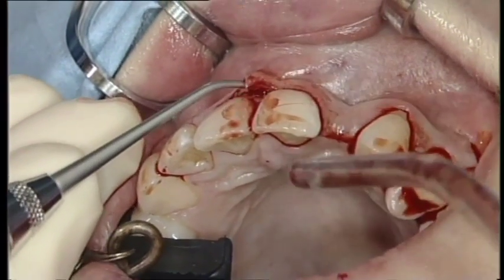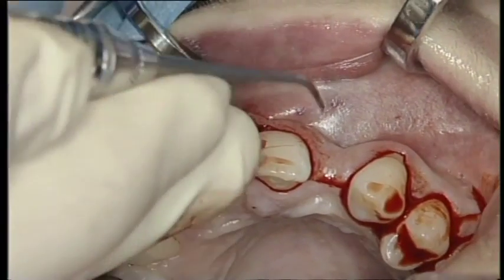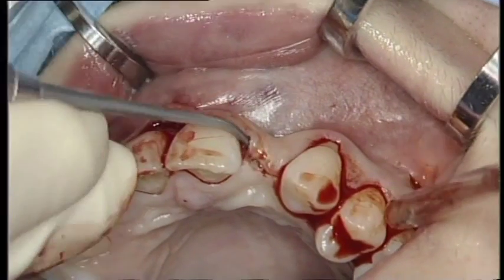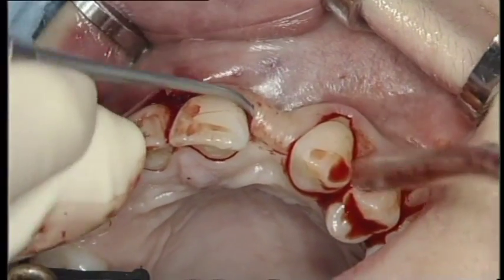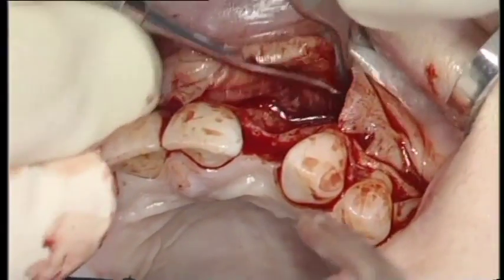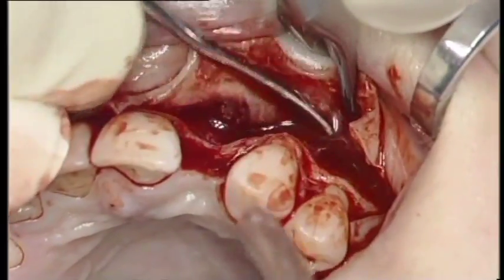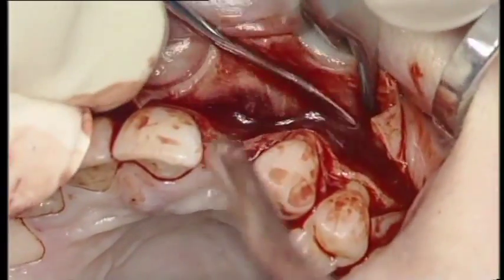The mucoperiosteal flap is carefully mobilized, first at the papillary area using a fine tissue elevator, and then in the crestal area. Next, the mucoperiosteal flap is elevated from the underlying bone with the paddle-shaped end of the PP Boozer instrument made by Hu-Friedy.